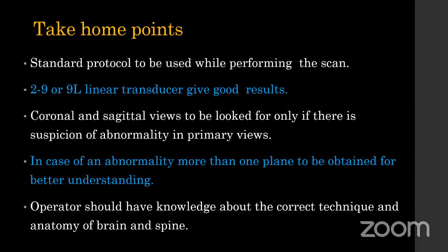And I would like to tell you, you need to always have another person when you're doing a neurosonogram, especially if it's TVS. You need to fix the head at some point of time, and then you need to maneuver the probe so as to get the best views to diagnose the anomaly.